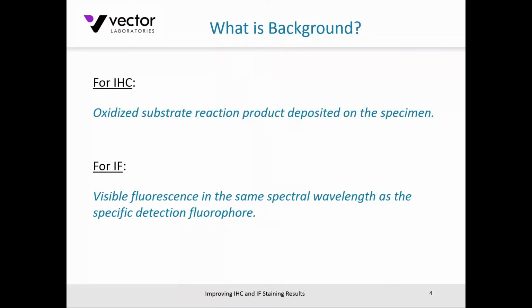For immunofluorescence, it would be a visible interfering fluorescence in the same spectral wavelength as the specific detection fluorophore. So the example would be if you're using a fluorescein, a green conjugated secondary antibody to look at a target antigen, and you've got some confounding fluorescence in that same green spectra.